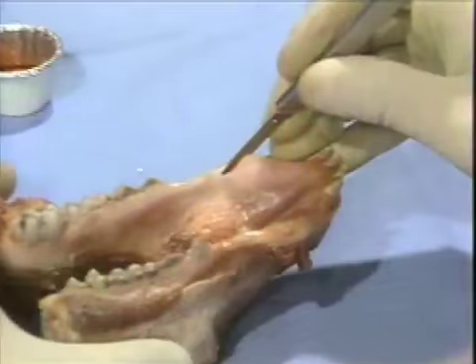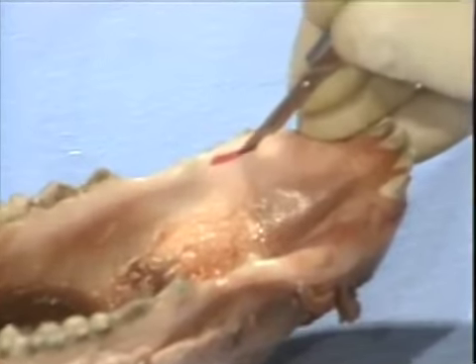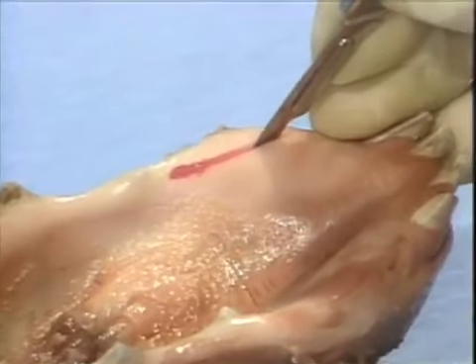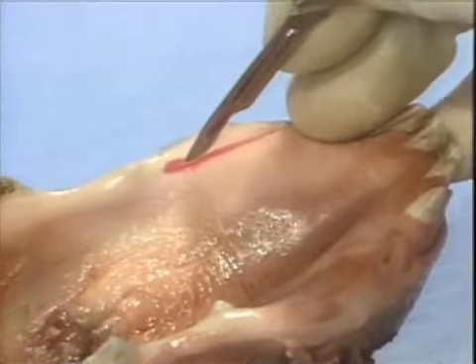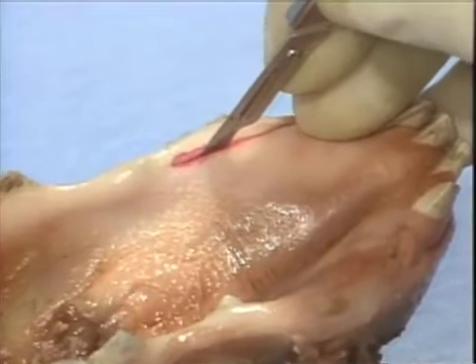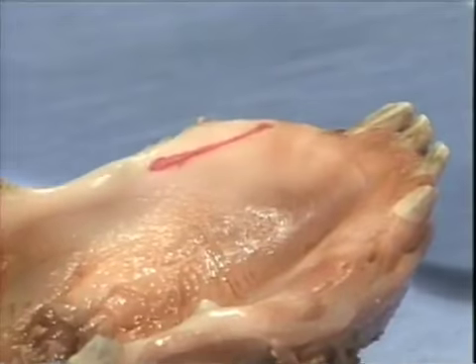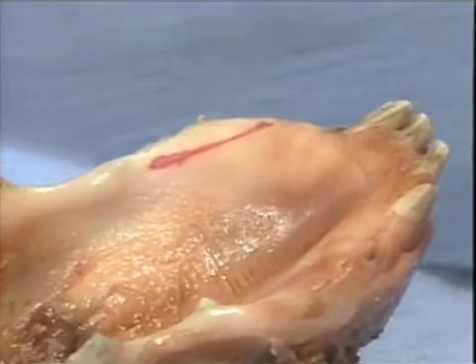We will first demonstrate the elevation of a full thickness flap by first making an incision over the crestal tissue down to and including periosteum. This incision must be retraced to ensure a continuous incision through periosteum from mesial through distal.